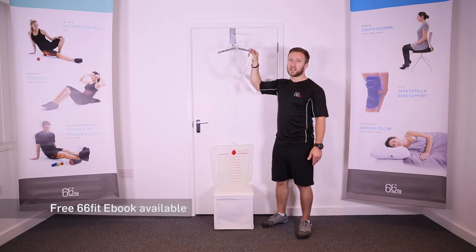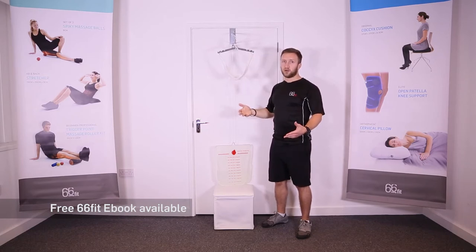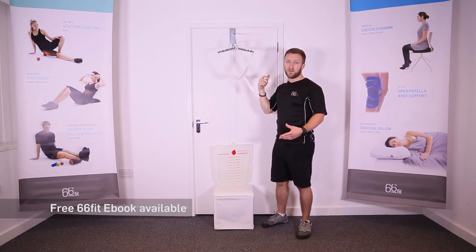I'm going to show you how to use this now. You can fit it two ways: one, ask a friend to help you, or this way that I've shown you, which is the easiest way that I've found to put it on.